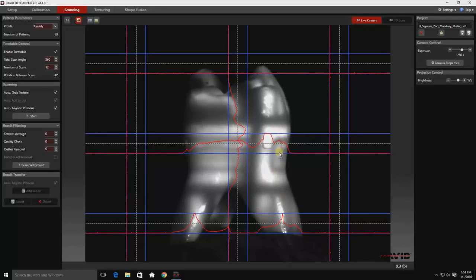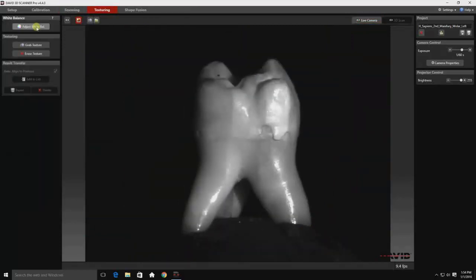You can see where the cursor is there's a small square. This is essentially the target inside the projected calibration. That square, especially when working with small objects, is essential to position that square center on your object.